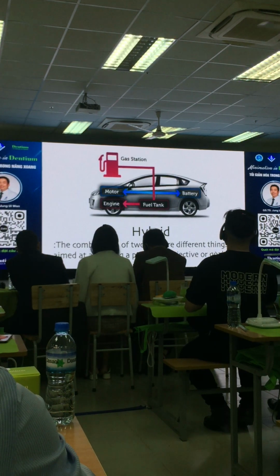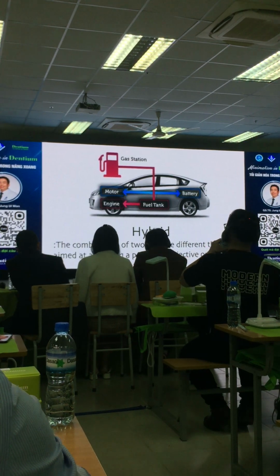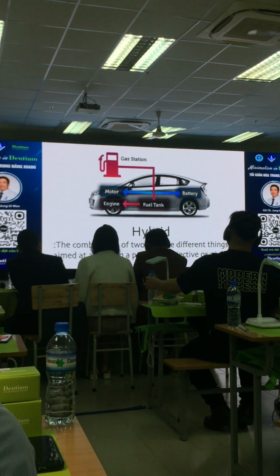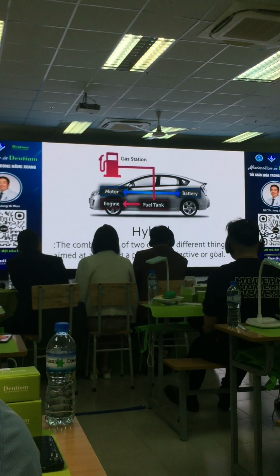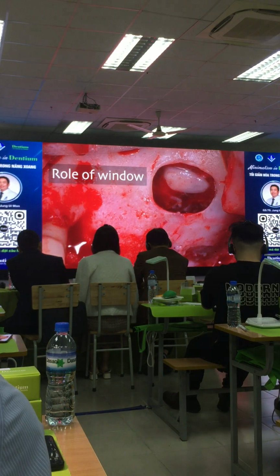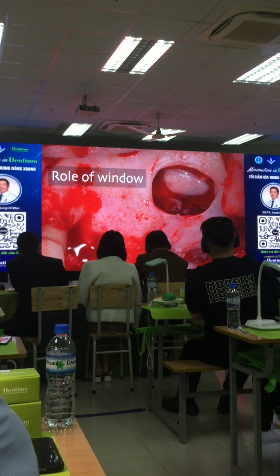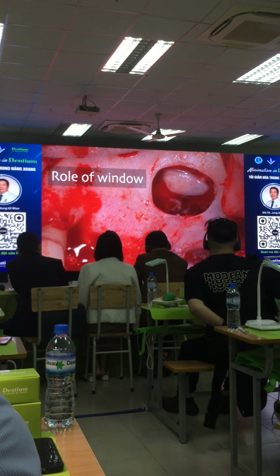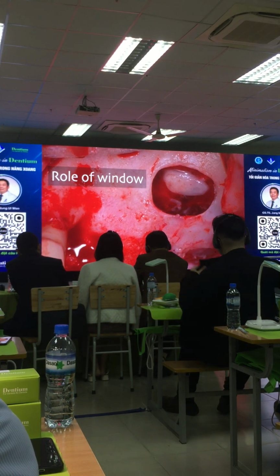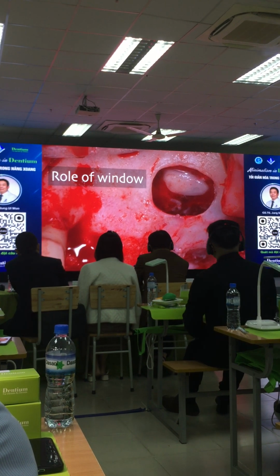The definition of a hybrid is the combination of two or more things for some synergy. As said previously, combining the advantages of the lateral and the crestal approaches could produce a synergistic effect. We need to know the actual role of the access window. The first role is a gate for instrumentation. The sinus membrane elevator is accessible through the window. The other role is a passageway for bone grafting material.